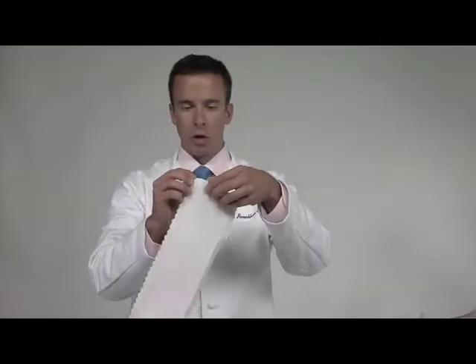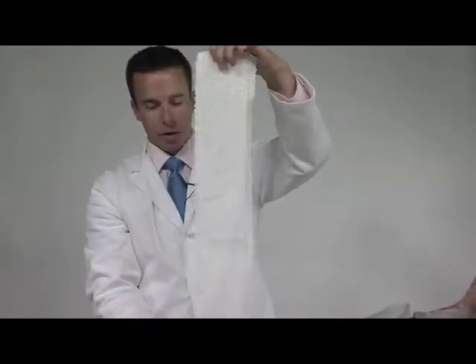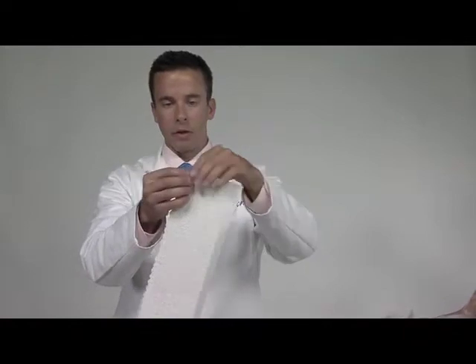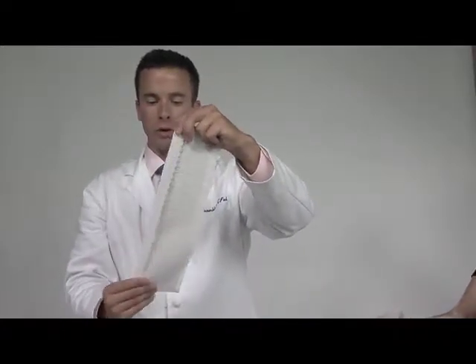To prep your splints, take your 30-inch by 5-inch splint and fold it in half like this, then take three-quarters of an inch on top and fold like this. It's a little bit easier to do on a hard surface, but you get the idea — to get that rim for the top of the slipper cast.